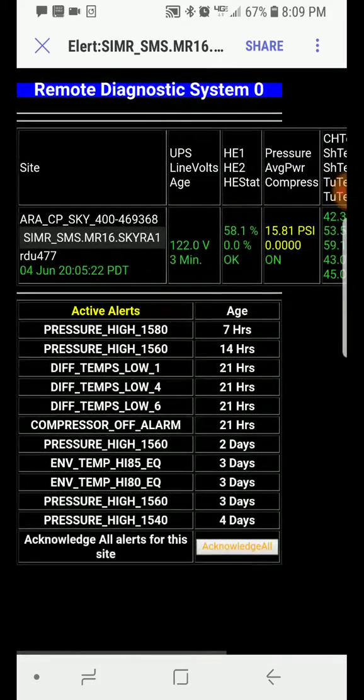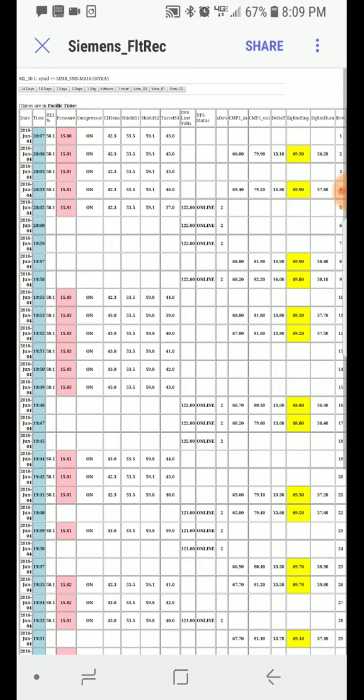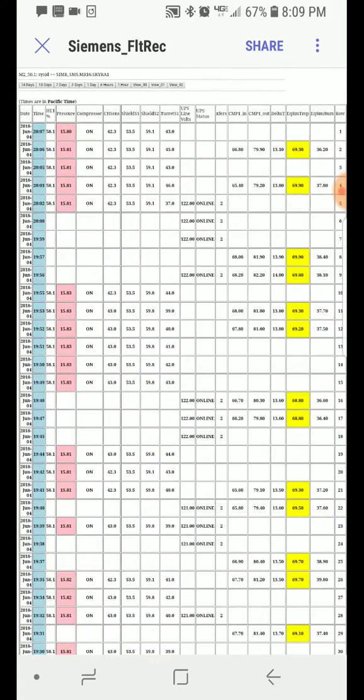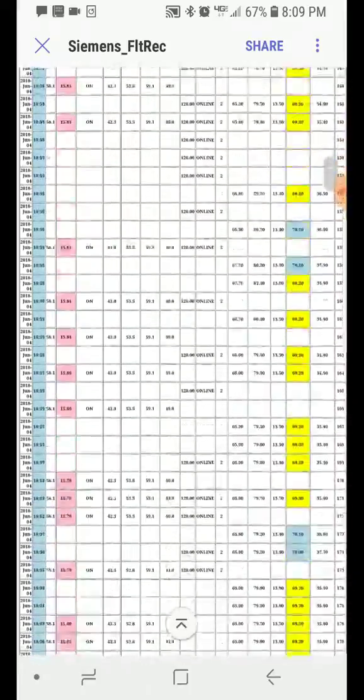So let's dig into what these things look like in the flight recorder, we call it. So let's click this button here, and it'll take you to spreadsheet fashion information that you were looking at on the green board. This is a historical view. What we were just looking at is a real-time view. Let's look at a one-day view here, and then we can go to this actual error.